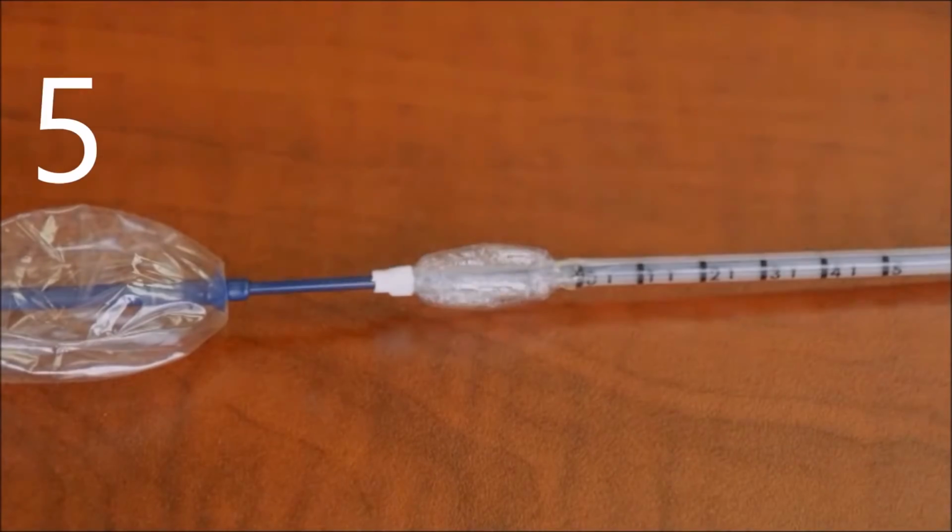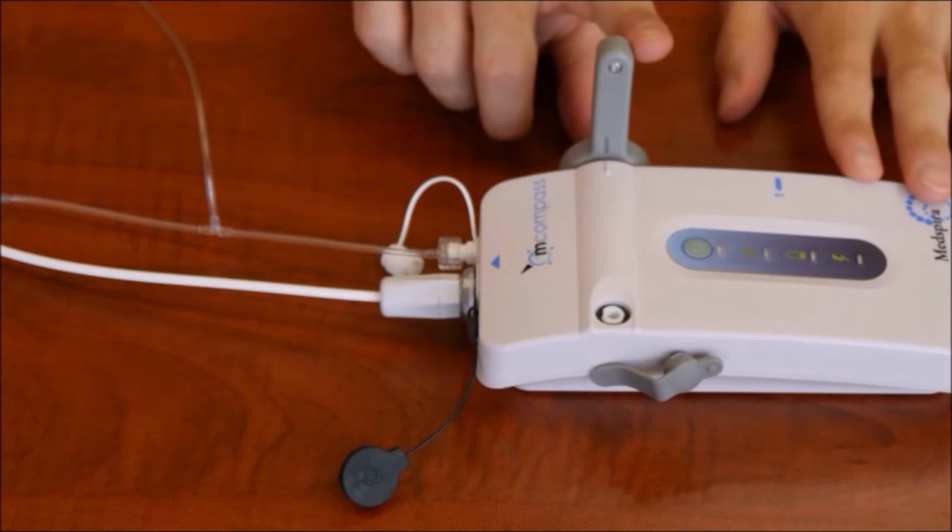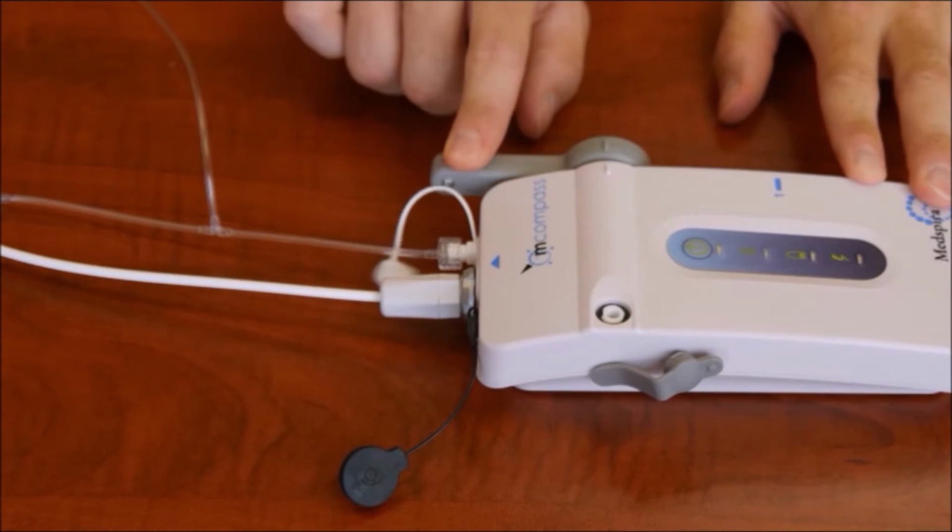After you inflate the sphincter balloons, you will be able to hear and see the pressure decrease as it normalizes to the room. And then move the lever to position 3 or operate.